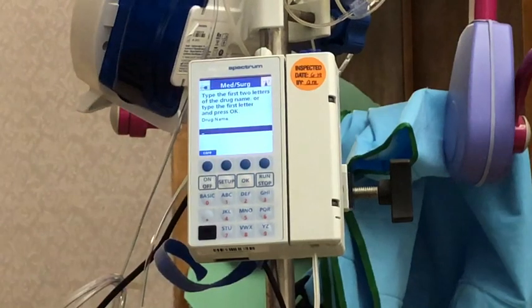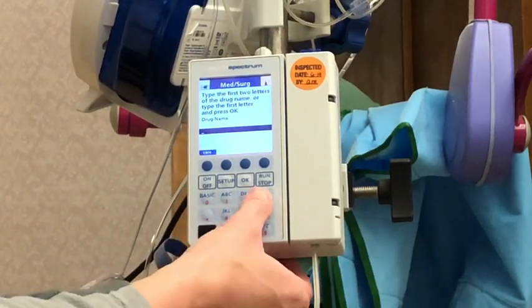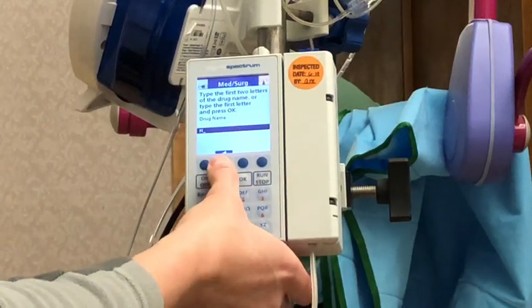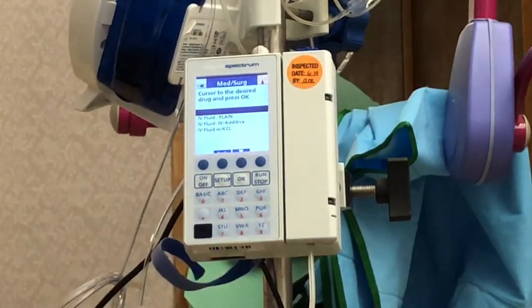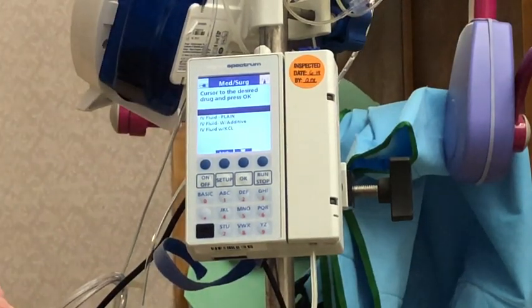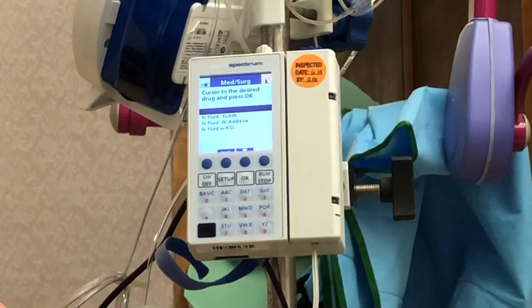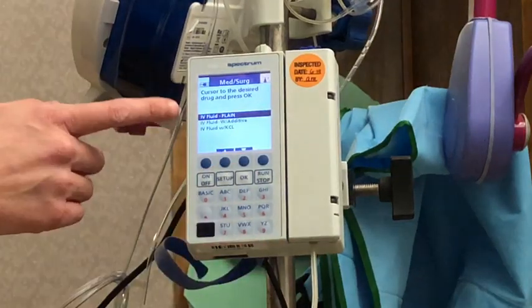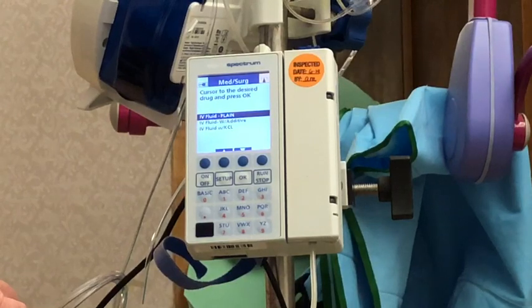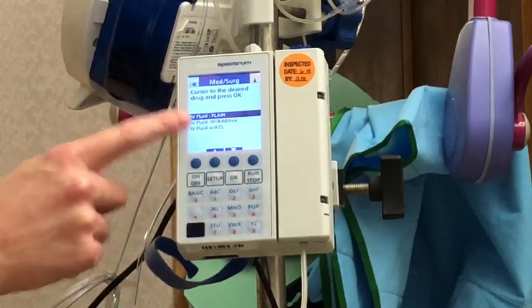Once I've selected my area I'll hit okay, and then you can select your drug. I typed in 'IV fluid' for IV fluids, which I'm going to run. If you wanted to type in vancomycin or ancef or anything like that, you'd just type in the first few letters and it'll give you a list of medications to choose from. I'm going to pick IV fluid plain — there's also IV fluid with additive and IV fluid with potassium, but I'll pick IV fluid plain.